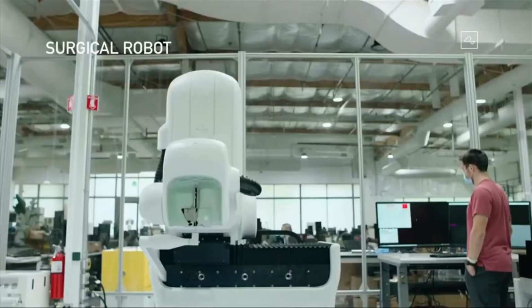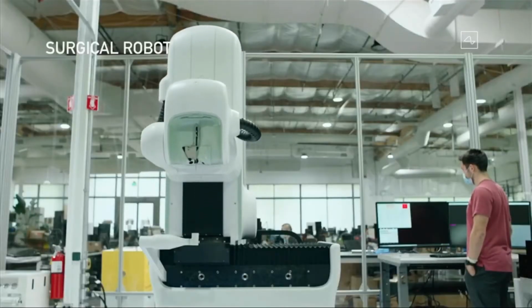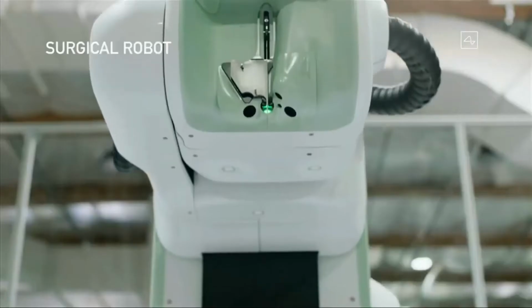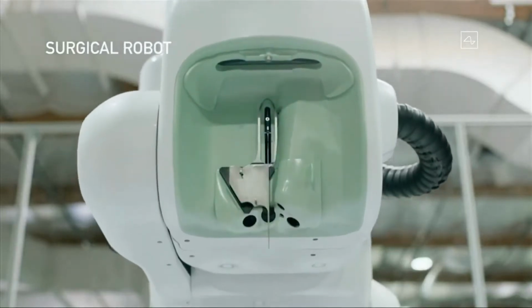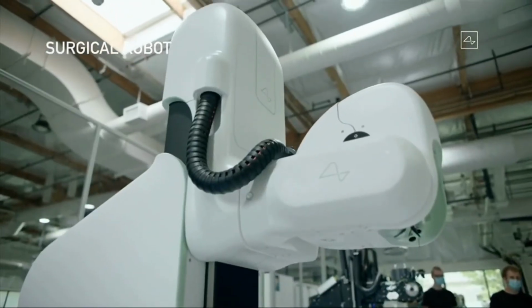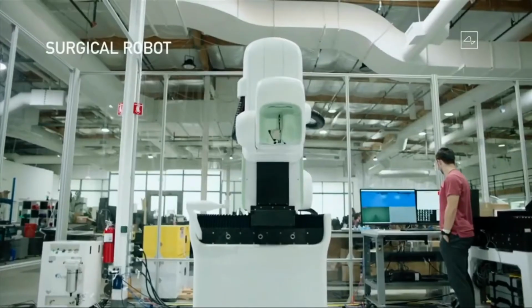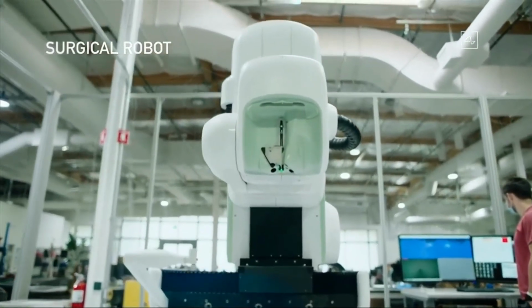The Neuralink chip will be installed using a robotic machine and not by a human surgeon. This is because the machine will scan your brain and detect the exact location where the small wires of the chip can be connected to the neurons. Elon Musk also said that the chip can be removed, and after removal, the person will not have any side effects and can live a normal life.